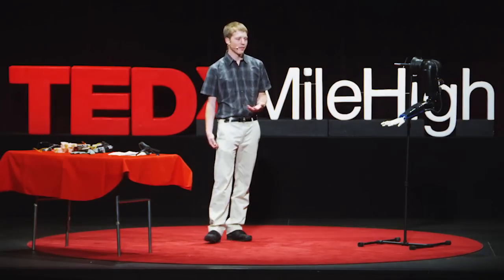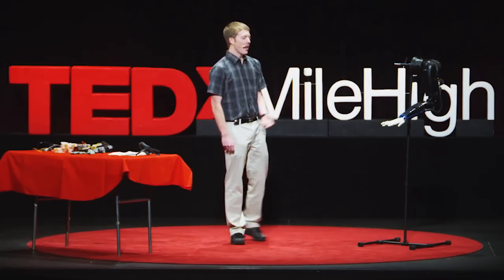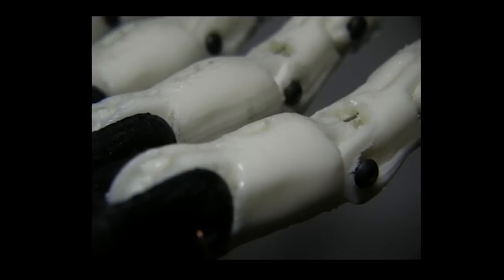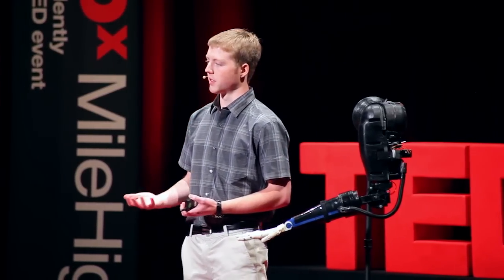With prosthetics, there's an appearance issue. Some people might want a really cool-looking futuristic robotic arm, while others want something that looks and feels just like a human arm — skin-wise and everything. 3D printing has allowed me to create really organic-looking objects — fingers, the whole basic shape. That makes it easy to put silicone skin around it, which also decreases cost because it requires less silicone and makes it look more human-like.